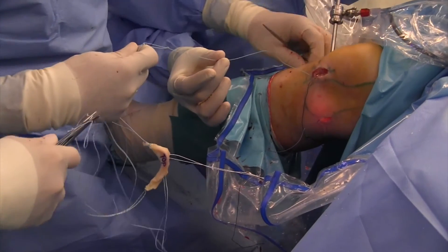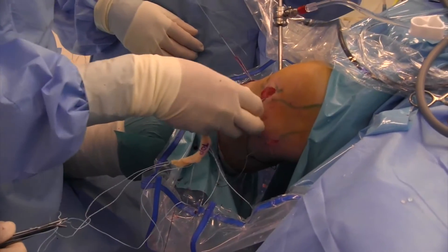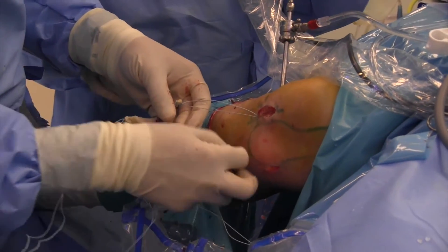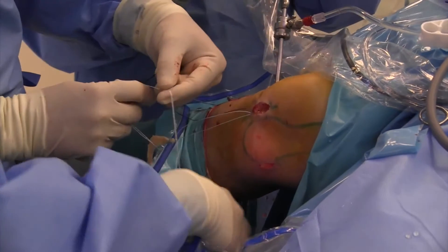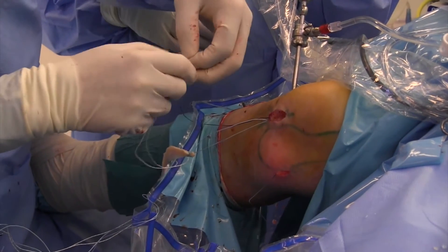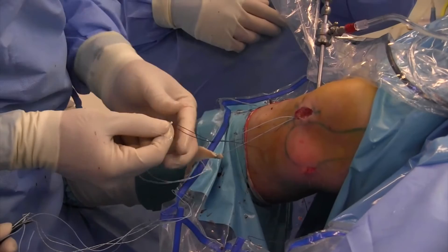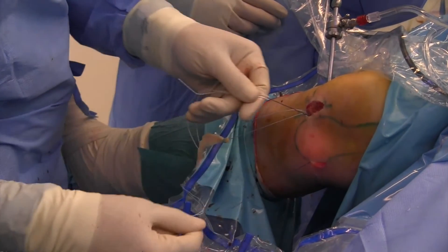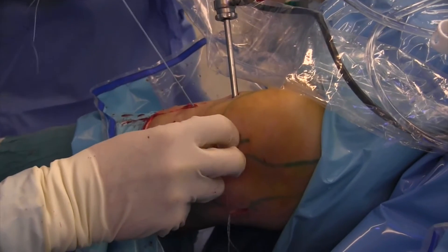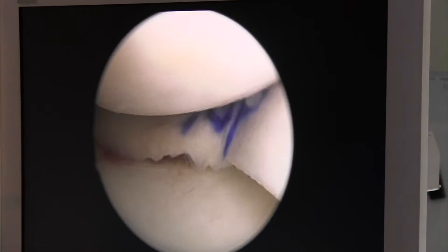First, the plug at the posterior horn is pulled into the joint. The suture through the posteromedial incision is pulled out of the joint. Now the meniscus is pulled into the joint through the arthrotomy, first by putting on the trans-tibial suture and then through the posteromedial suture. And now it flips into place.